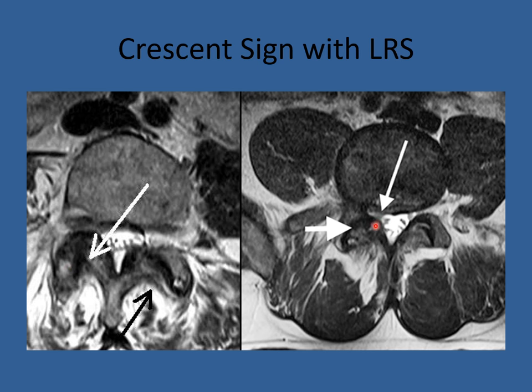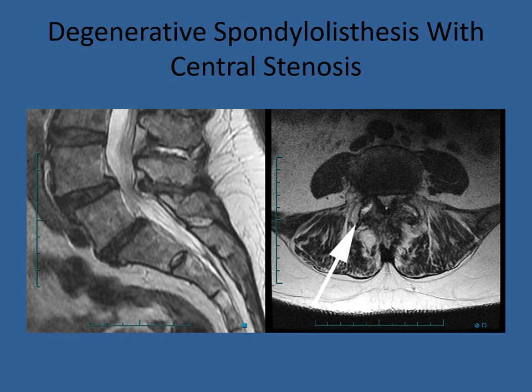This subluxation creates a condition called lateral recess stenosis. Here, one nerve root looks free, but another nerve root is under duress. As the patient stands up, the vertebra can move forward, trapping the nerve root and creating buttocks and leg pain. Degenerative spondylolisthesis can create central narrowing, and that central narrowing creates stenosis. Here's an example where degenerative facet disease has narrowed the spinal canal considerably and the nerves are compressed.